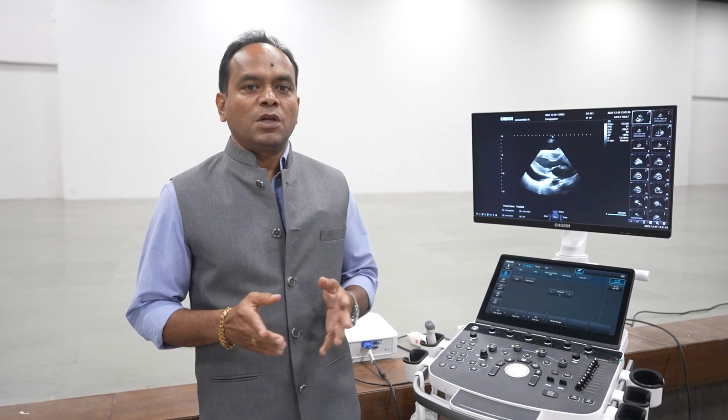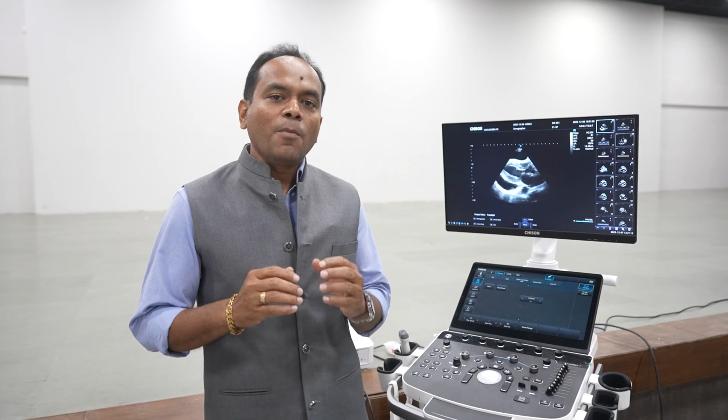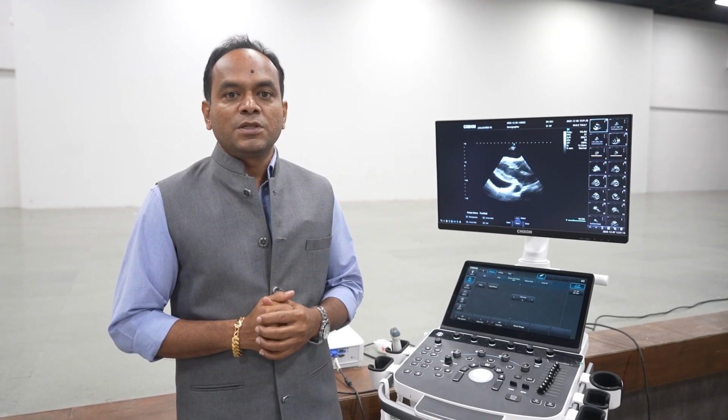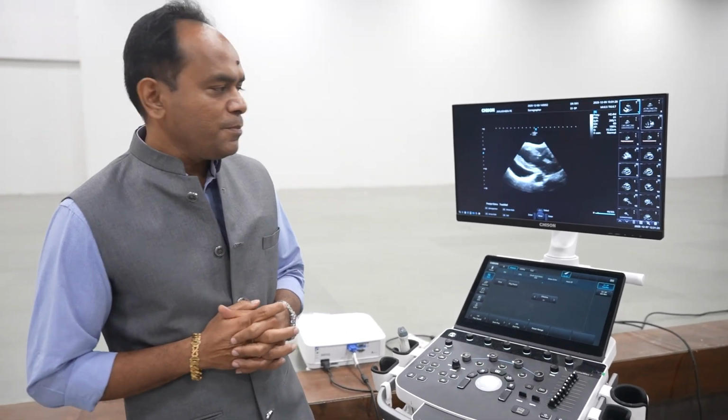Common echocardiographic features, I would say, in patients of pericardial effusion. Now we know that pericardial effusion is a very life-threatening condition if the patient lands up in cardiac tamponade. So let us quickly, without wasting time, see what are the common echocardiographic features once you put a probe on any patient who is suffering from pericardial effusion. So let us go straight to the echo machine.